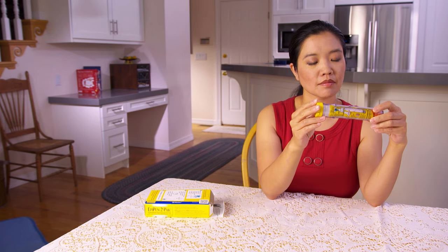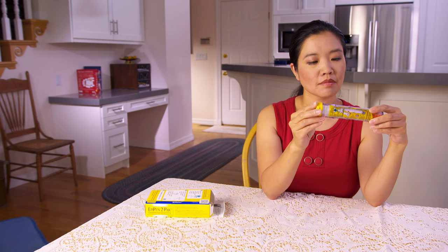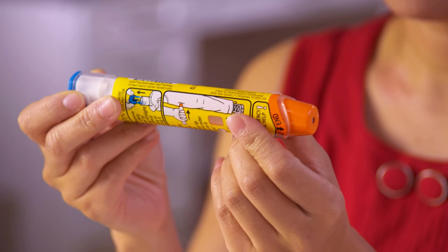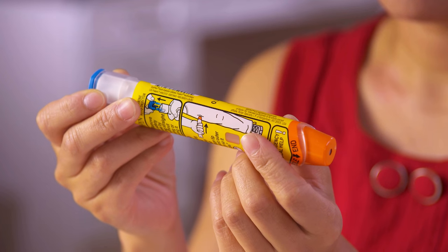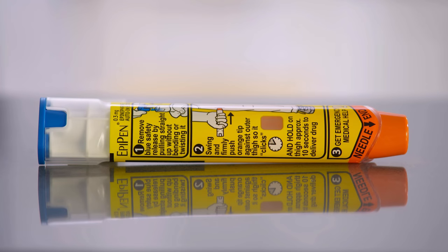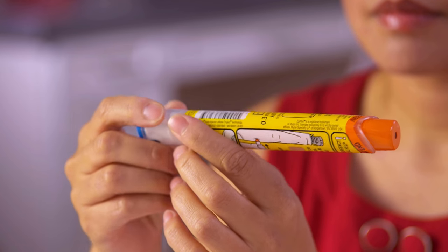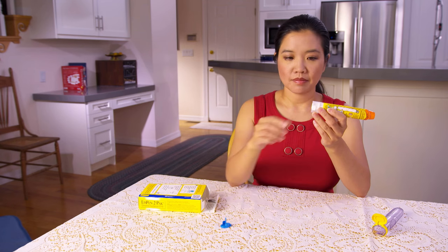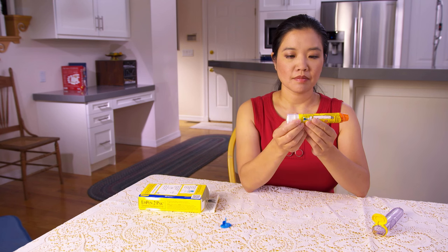If you need to use the auto-injector, uncap the case and slide the injector out. You'll see a tip that's usually orange or yellow. The needle will come out of this tip when you use the injector. To avoid accidentally sticking yourself with the needle, you should never touch the colored tip. Before you use the auto-injector, you must pull off the safety cap. In most cases, this cap is gray or blue.